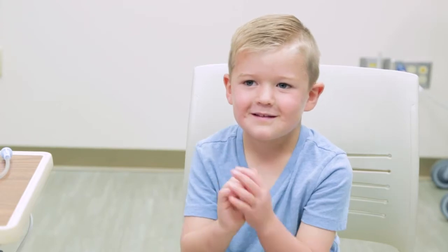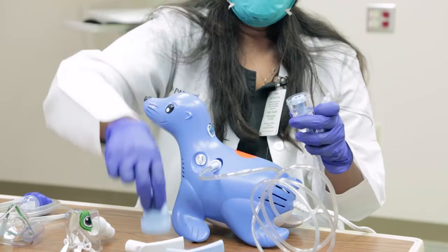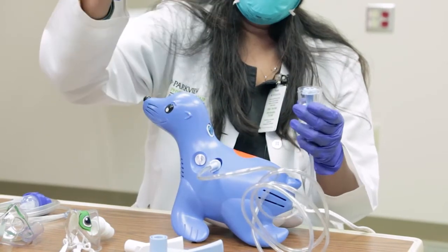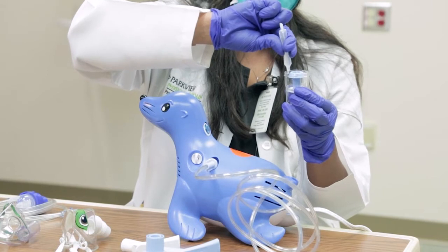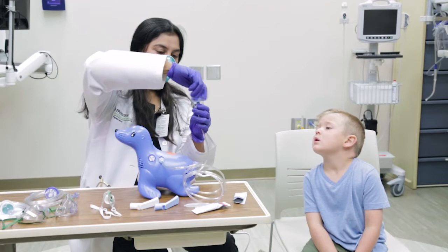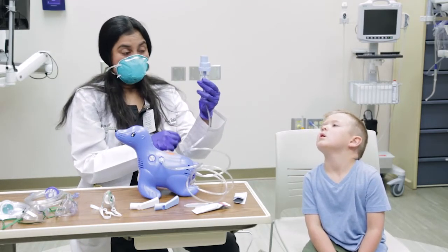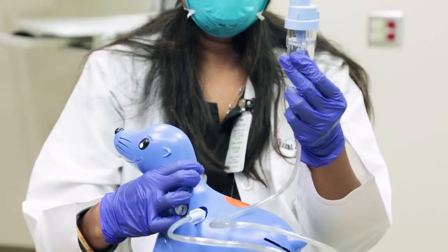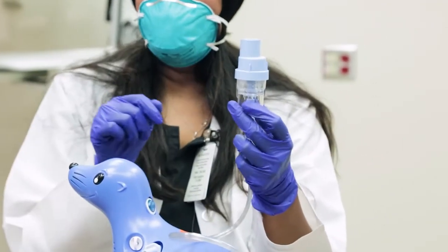Today I have Ben with me and he's here to show us how to use the machine. This is albuterol — this is one of the basic medications that's usually prescribed. There's the medicine and you just put it right in there. It is a liquid when it goes in. Then you close the lid and, after you put the liquid in, make sure you're holding it upright so the medication does not spill. And that's exactly what you want to see.